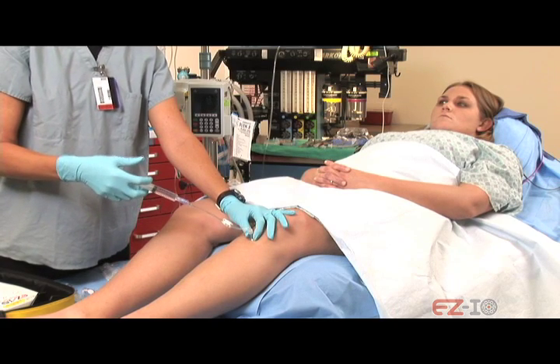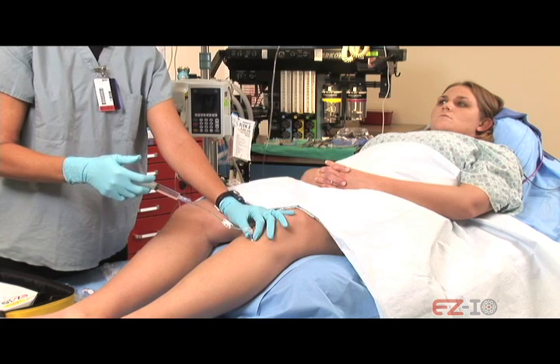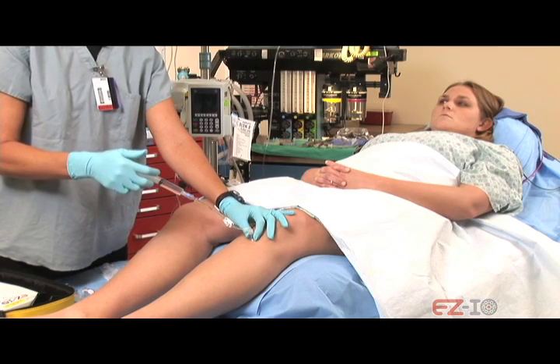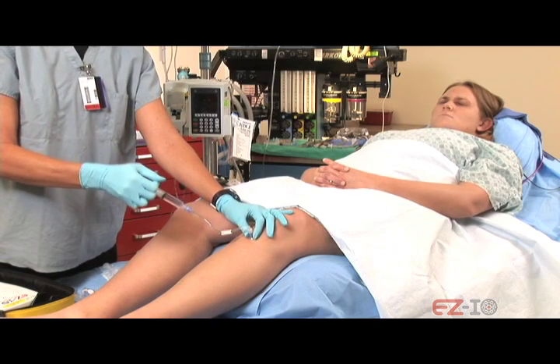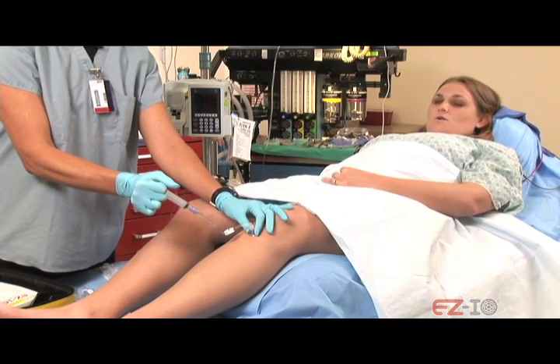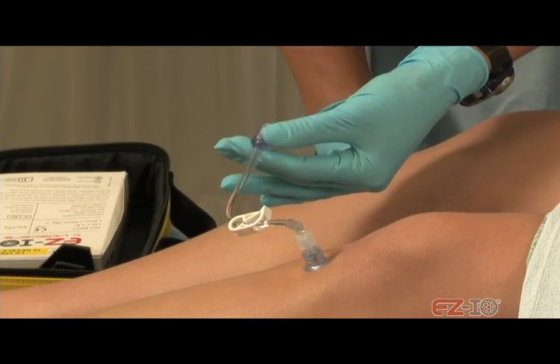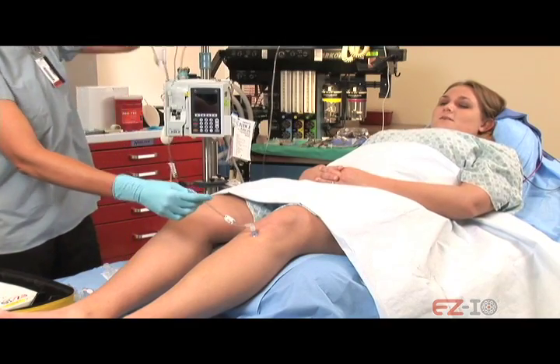All right, now this next flush needs to go in pretty quick. It's going to take me about 5 seconds, so I'm just going to count down with you. You're going to feel some pressure and some stinging pain when I do that. And then I'm going to be done in 5 seconds, okay? Are you ready? Yes. Okay. 1, 2, 3, 4, 5. Okay? All right. What's your pain level right now? Like a 4. Okay.